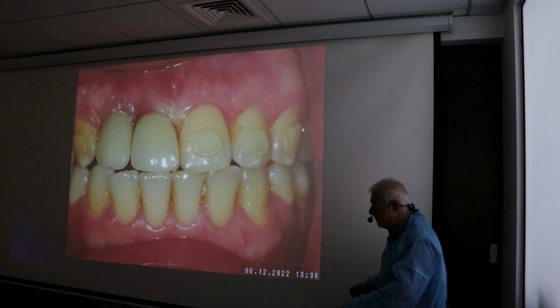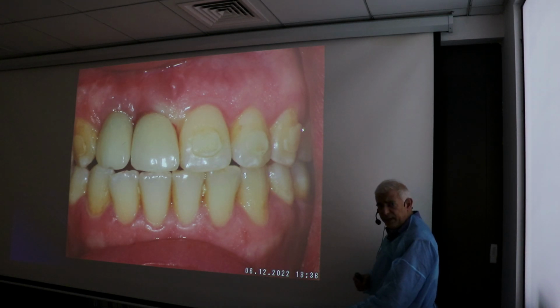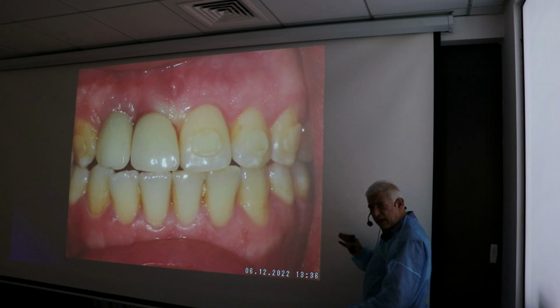You remember I said make a model? When I asked what would you do differently, you have a minute to express your frustration. Who wants to express their frustration? What should I have done and I didn't? You could have placed it a little deeper. Give more room to the gum too. Okay, that's possible.